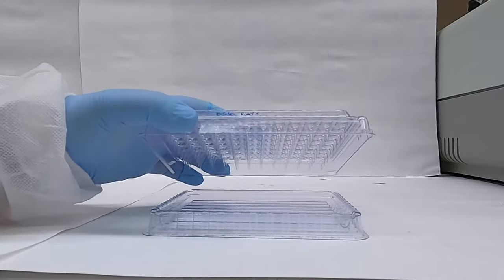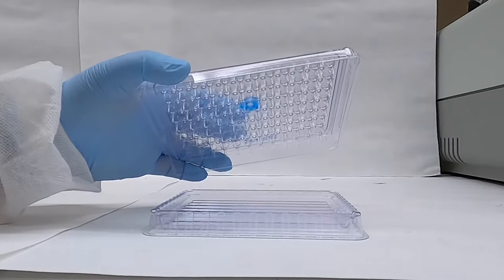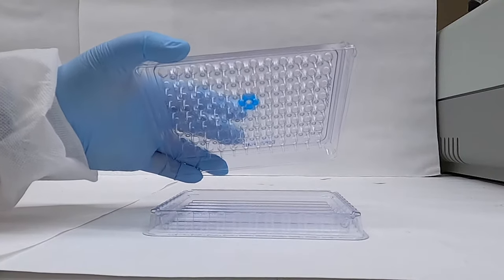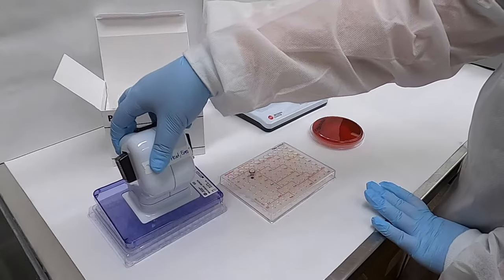You can see here that the lid of the dispensing device contains these 96 micropipettes which are responsible for transferring our bacterial suspension from the reservoir into our susceptibility test plate which you can see here on the right.